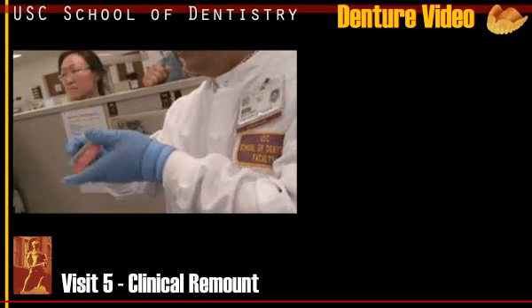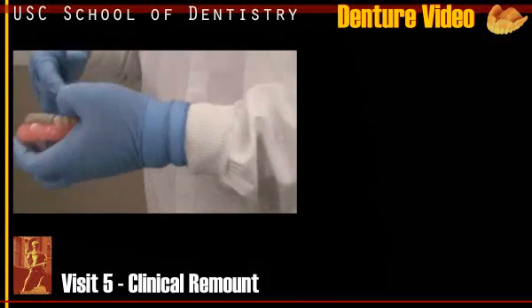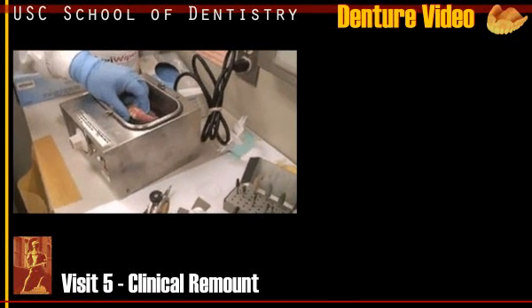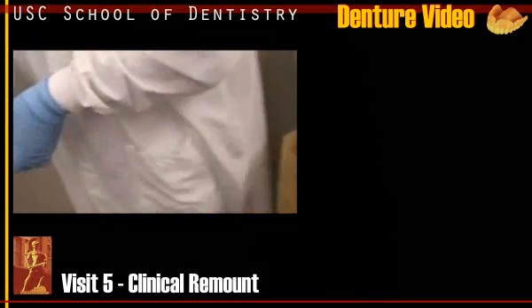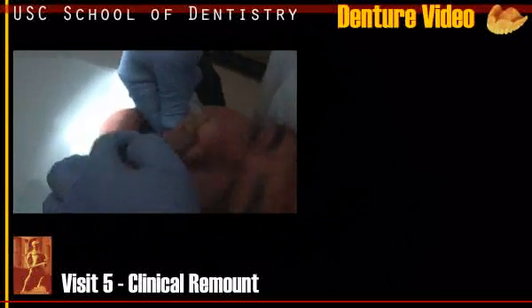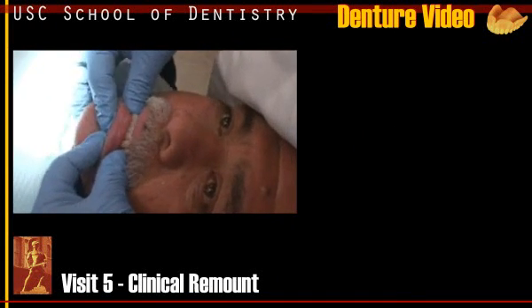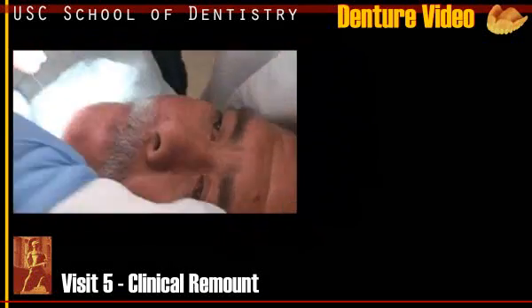You're a little bit slow, so this is already hot. Don't take it out. Just put it in. Because this water is only 110 degrees, so you're not destroying the denture. Okay, so put it in here, tempering again. Tap, tap, tap, a little bit of water out, and push it in. Oh, don't bite, don't bite. And then let me control it. Relax, relax, okay. Now open, open. Okay.